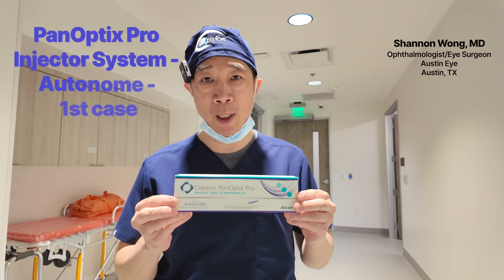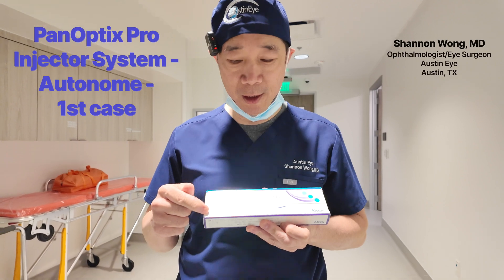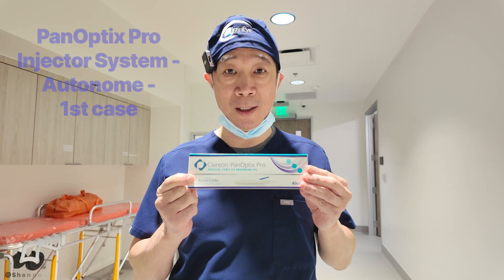It's May 27th. Today we're going to use the Panoptix Pro with this new injector system. It's called Autonomy. And I'll show you how to use the Autonomy system.